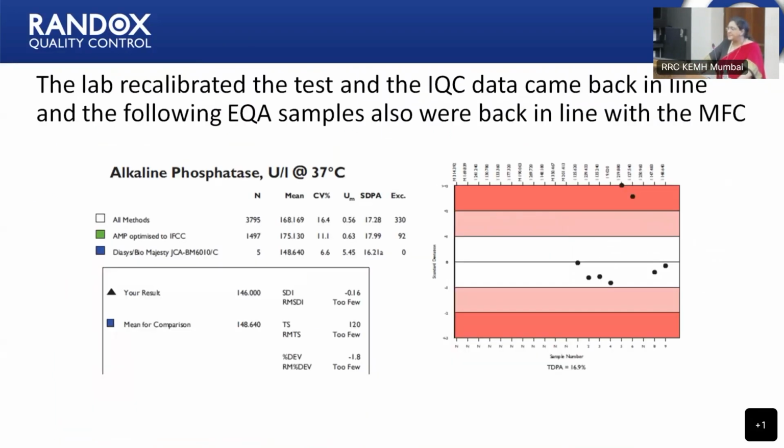We discussed this with the laboratory. The laboratory recalibrated the parameter, and after recalibration, the IQC came back within range, and the EQAS sample also came back acceptable.